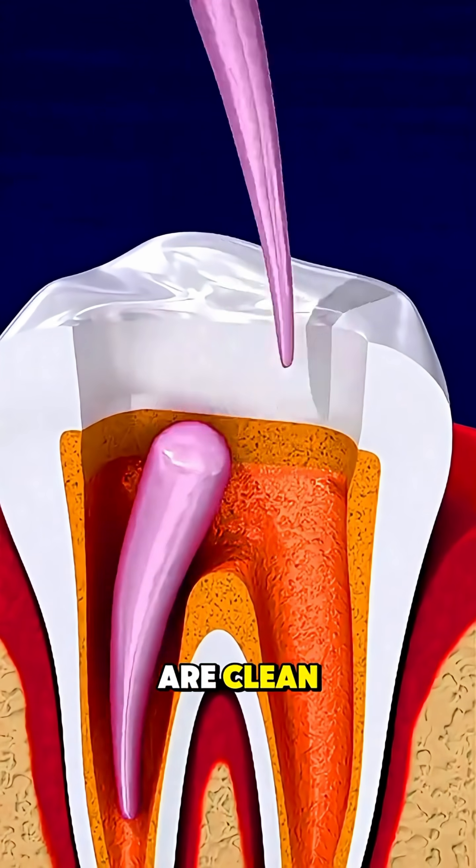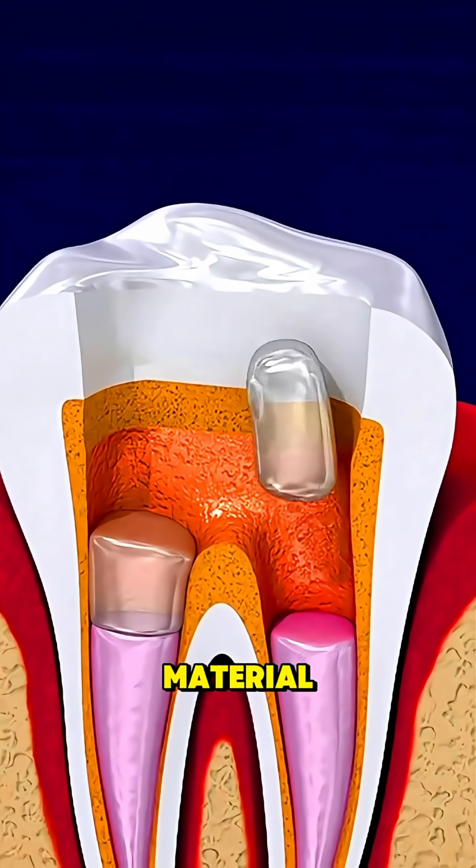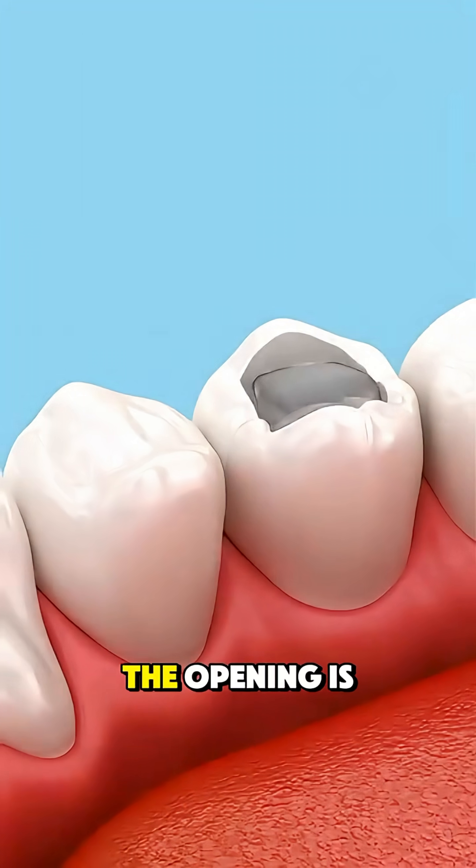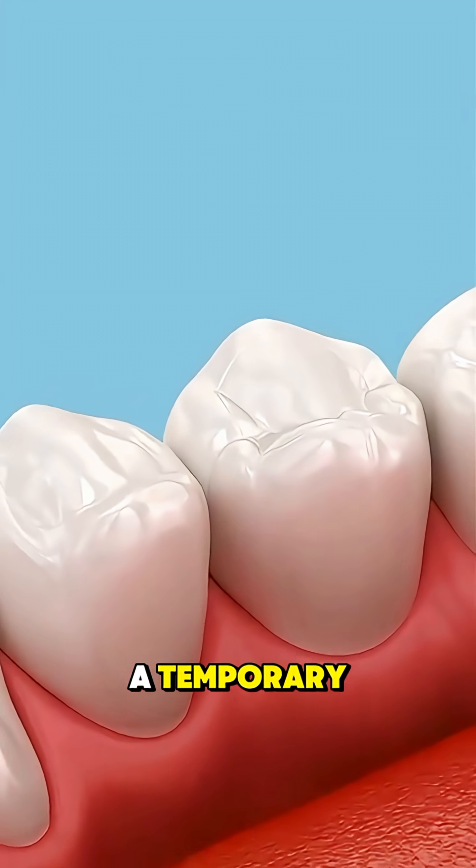Once the canals are clean, they're filled with a rubber-like material called gutta percha to seal them and prevent future infection. The opening is then closed with a temporary or permanent filling.